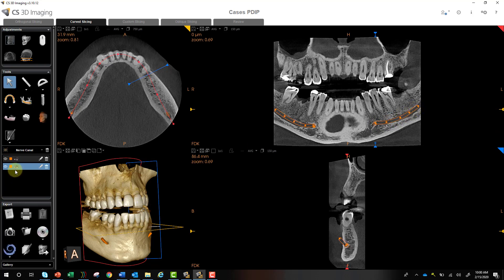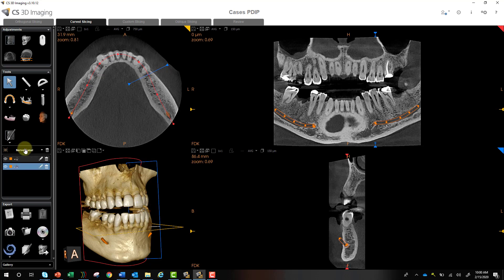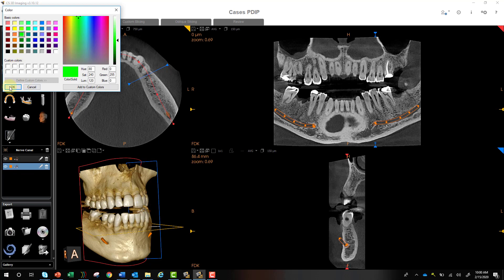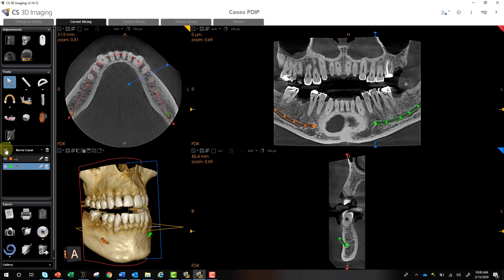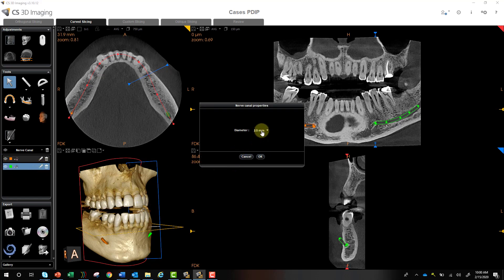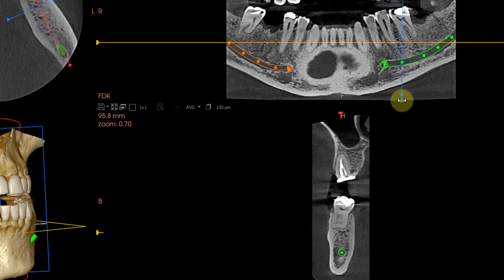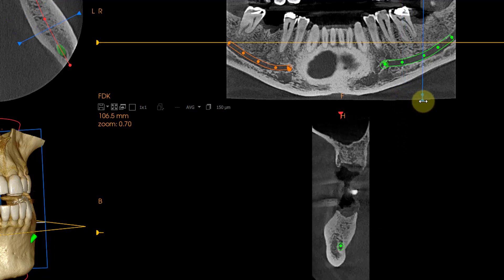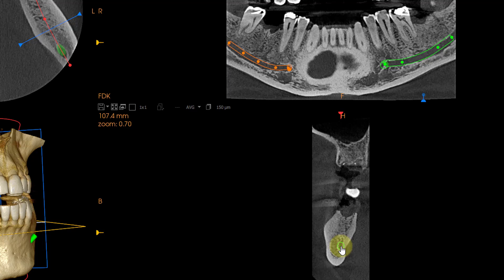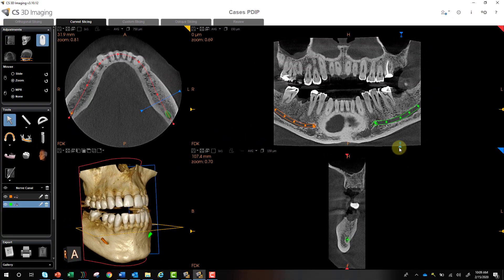Double-click, and you can see on the left-hand side your object toolbar. I can bounce back and forth to my measurements, my implants, nerve canal, and so on. I can change the color of one side if I wanted to, to help differentiate. I can use the little eyeball to hide them both or hide one at a time. I can also change the diameter — the default is 2.5 millimeters, but I can give myself a little cushion and change it to 3, 3.5, whatever I want. Now, when I move my cross-sectional toolbar around the arch, every time I'm on top of one of the little nodes where I've clicked, you get a little dot down below. If your dot is a little off from where the actual nerve is, you can move it if you can see the nerve in that view, and you're good to go.